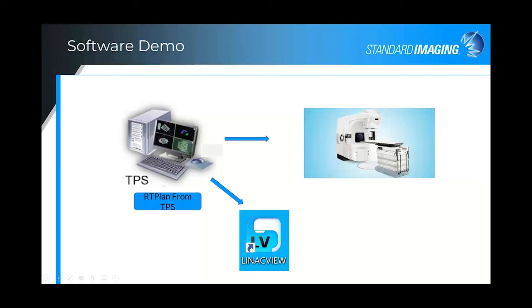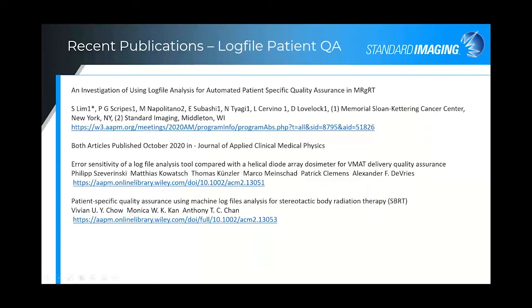And so that demonstration was at the point in which the RTPlans had been exported, and then the log files from the LINAC were brought into the software. So I wanted to next go over some recent publications, just to give you an idea of what's been published recently.